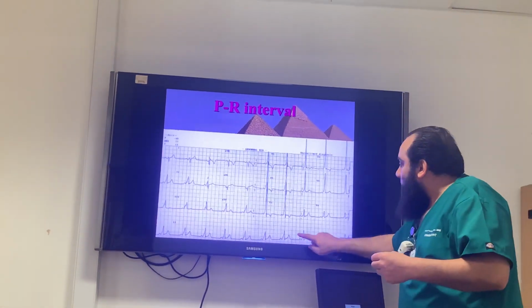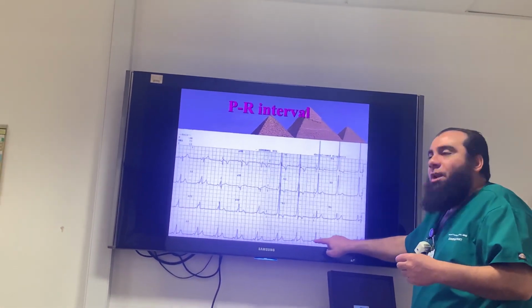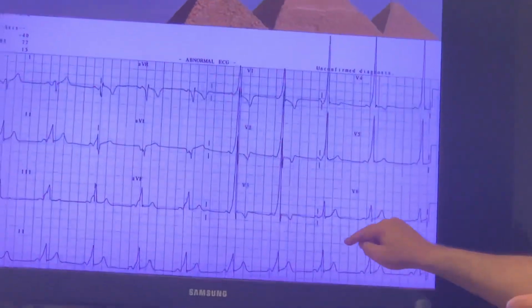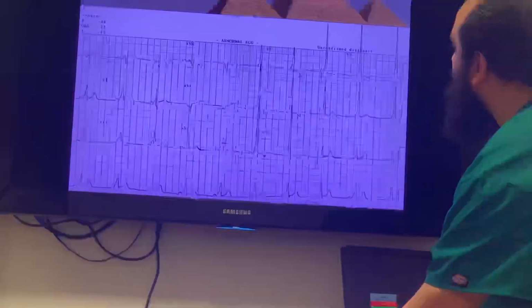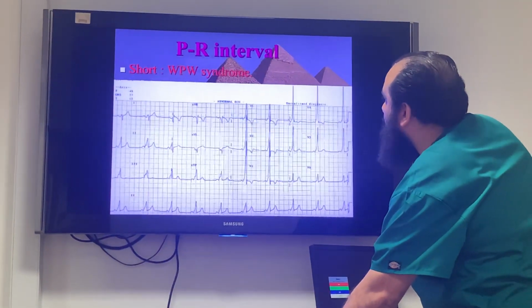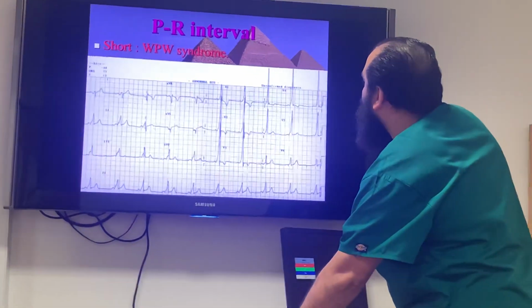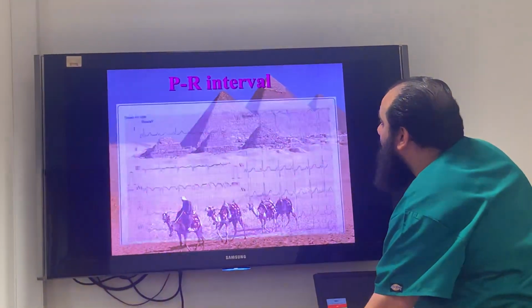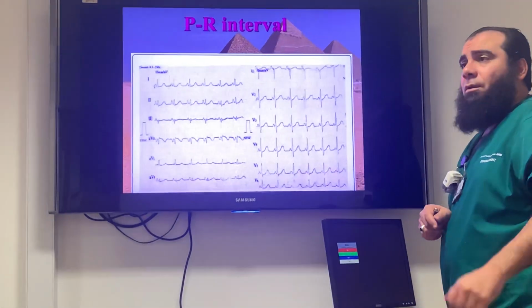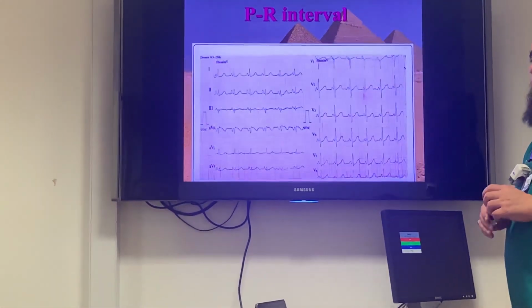Good. It's what we call WPW. Is that okay? Good. WPW. Okay. Do you have another example for short PR?